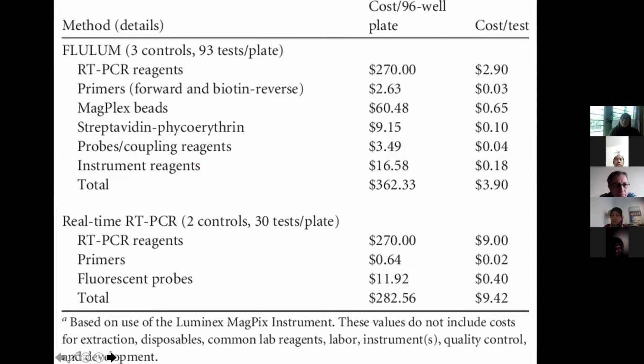So you can see the price for RT-PCR is expensive. The time of analysis is probably 6 hours if you are very efficient, but most of the time it is 24 hours, so probably the day after you can have the results. If you just Google or look on YouTube at RT-PCR steps, there are a lot of steps that have to be done before you can get results. And the price, all the reagents are expensive. This is in US dollars.